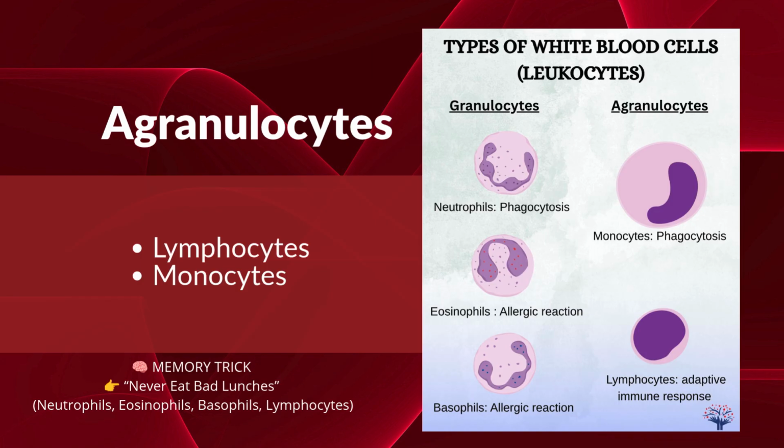Cell comparisons are very important: monocytes versus lymphocytes, and reactive lymphs versus blasts versus mature lymphocytes. We've got a comparison chart we're going to get to. Just try to remember what the nucleus and cytoplasm are supposed to look like for these cells.